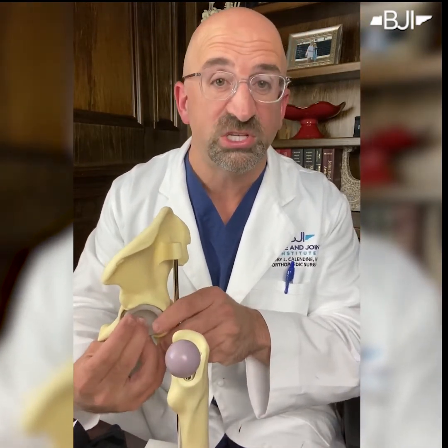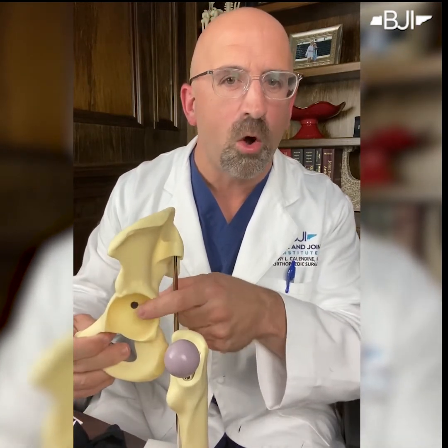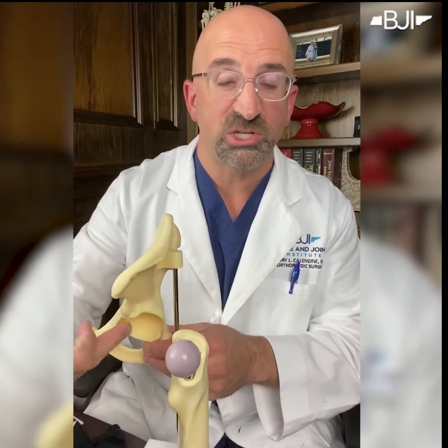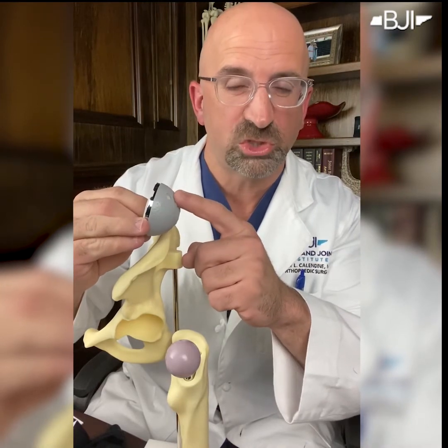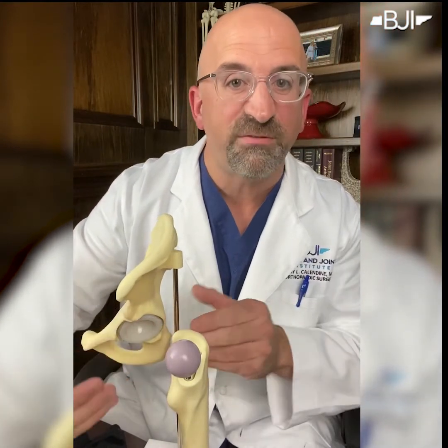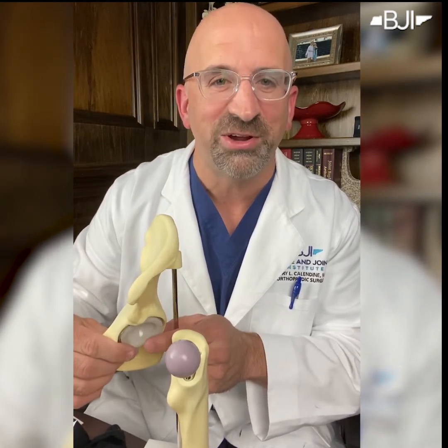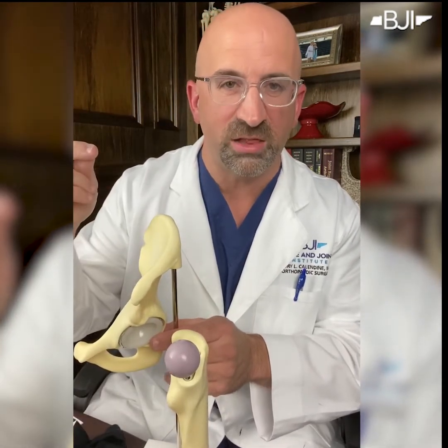Then we get to the cup side — the pelvis side. You can see in this model there's essentially a hole or a bowl-shaped area of the acetabulum. So what we do is we take specialized instruments to make sure that's nice and smooth, and then we place a metal shell — again, notice the roughened surface — into the pelvis. Oftentimes we press it into bone. And you'll notice there's a plastic liner inside. That's your new bearing surface — the new tread on your tire, if you will. So there are two parts on this side: a metal shell and a plastic liner.